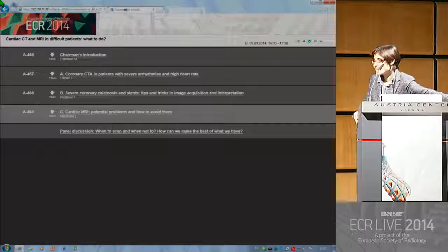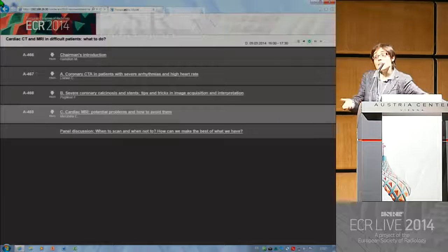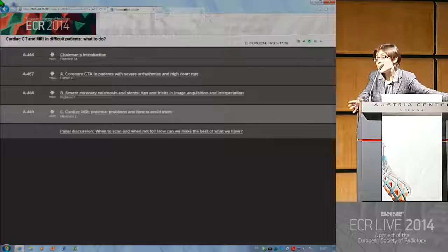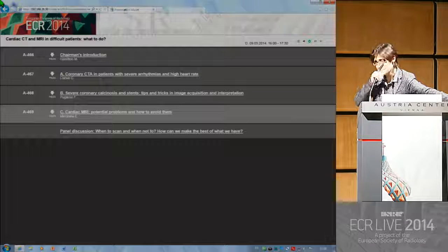So the algorithm is that I have to scan the patient every 6 months? Yes, the cardiologists decide when is a good time. It's probably not a good time before 3 months, because it would take at least 3 months for a significant degree of neointimal hyperplasia to develop, but it will be the cardiologist who decides the right timing, normally at least 3 months after the angioplasty.